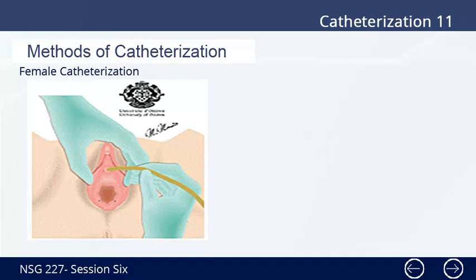Sterile technique protects the client and prevents spread of microorganisms. 11. Put on sterile gloves. Grasp the upper corners of the drape and unfold without touching the unsterile areas. Ask the client to lift up her buttocks and slide the sterile drape under her with gloves protected by cuff. The drape provides a sterile field close to the meatus.